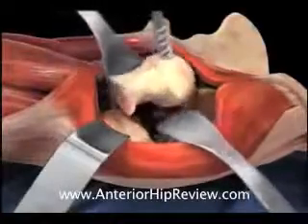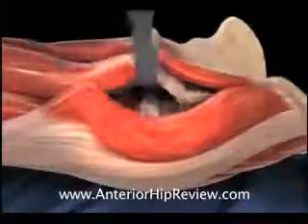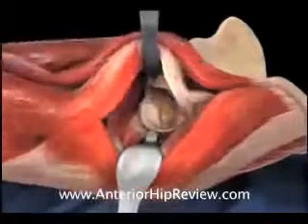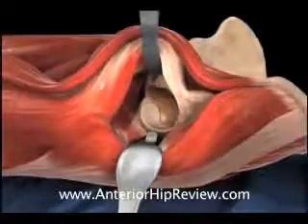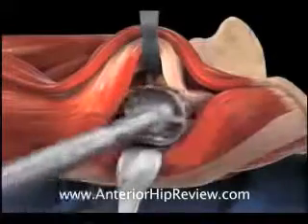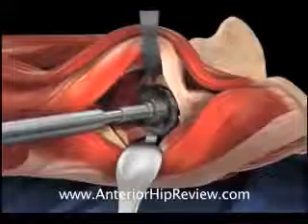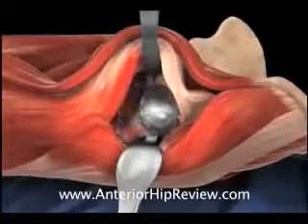Soft tissue retractors are now placed about the acetabulum to facilitate acetabular exposure in preparation for acetabular reaming. An acetabular reamer is brought into the acetabular socket and the remaining diseased osteoarthritic cartilage is removed prior to pressing in place the acetabular component, which grows solidly into the bone. A plastic bearing shell is then snapped inside the acetabulum.